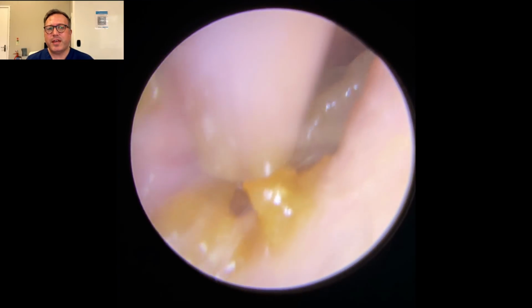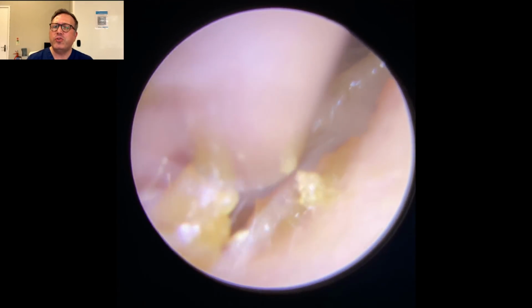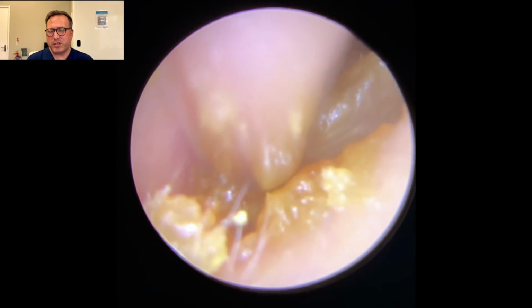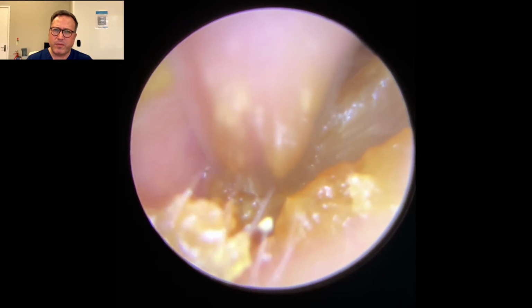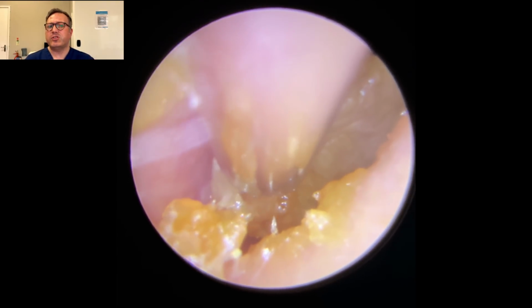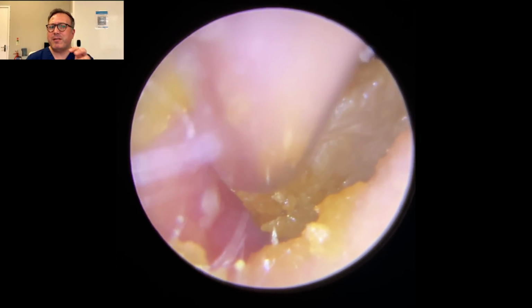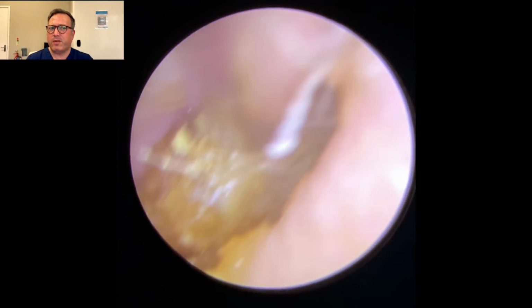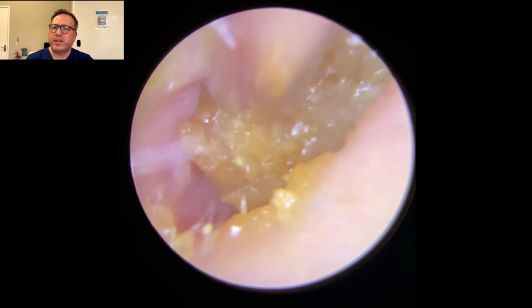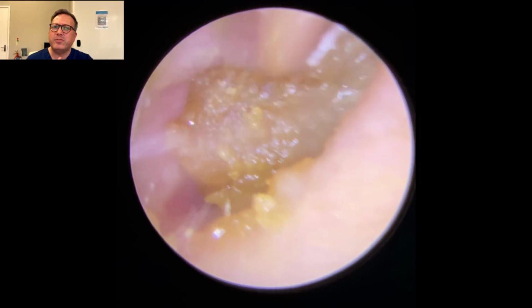So what you can see here, we've got this lovely patient who's come through, two very blocked up ear canals. You can see the sheen on the wax. This means the patient has been using a little bit of olive oil just to try and soften the edges of this wax. Now, olive oil does two things. It softens the outer layer of wax, so it makes it a bit easier for us to get a good grip as far as the suction tube is concerned.